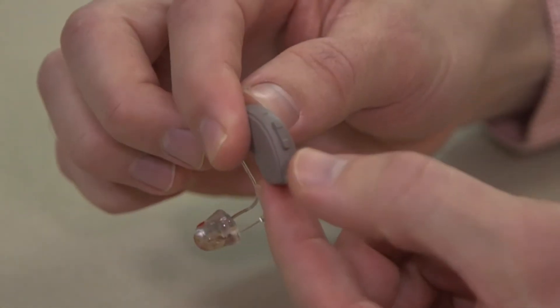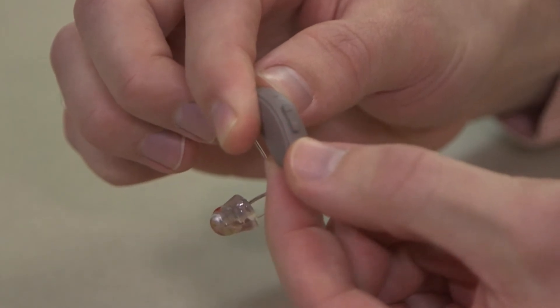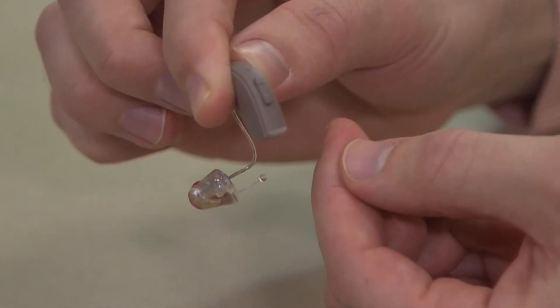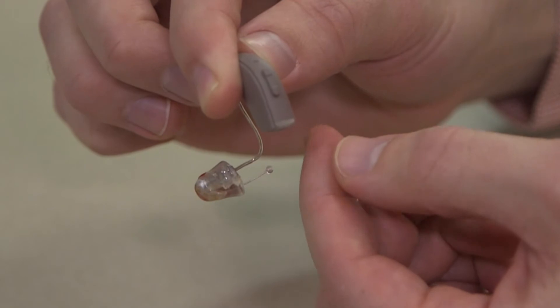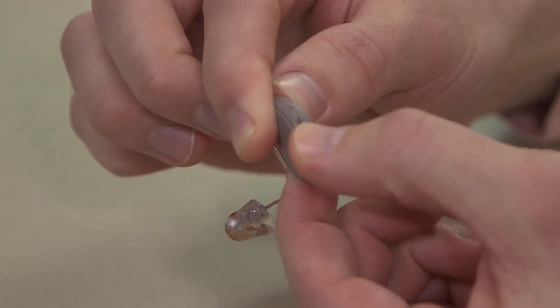One way is to have a button on the hearing aid designated to switch into a streaming capability. We currently have this set of hearing aids activated so that a down press on the volume toggle switch switches into streaming mode.